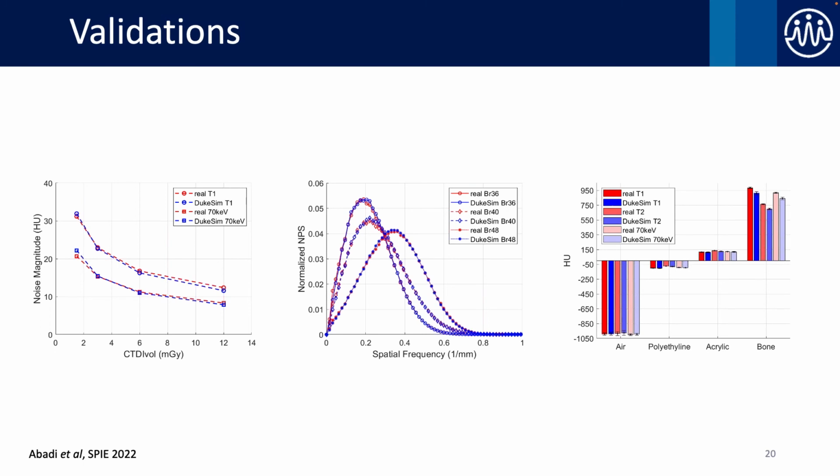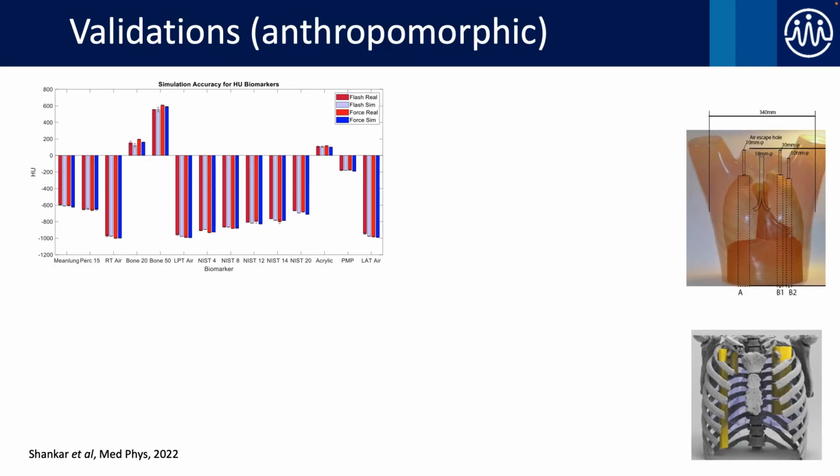And the results demonstrate that in terms of image quality, you are very close to what you see in the real experiment. And that gives us confidence that at least for these metrics, we are very realistic and we can use these models of virtual scanners.